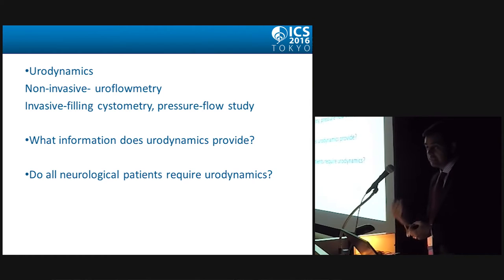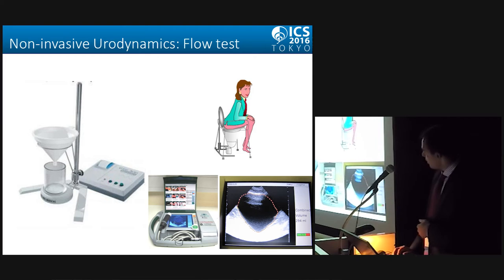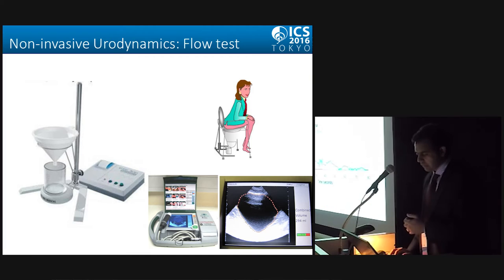One is, what is the information that urodynamics provides? And most importantly, does every neurological patient require urodynamics? So you heard about the non-invasive urodynamic tests, and most of you would probably be performing these in your clinics, where the patient voids into a portable commode, most often with a spinning disc, and the flow is recorded. After that, of course, the post-void residue is measured, either by in-out catheterization or more commonly by ultrasound, and you have an idea about whether there's incomplete bladder emptying.